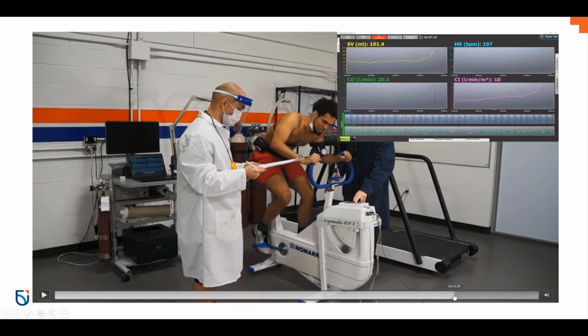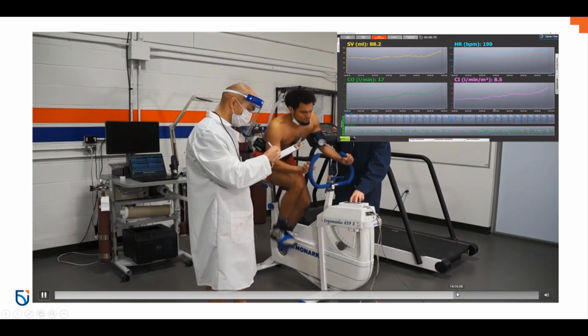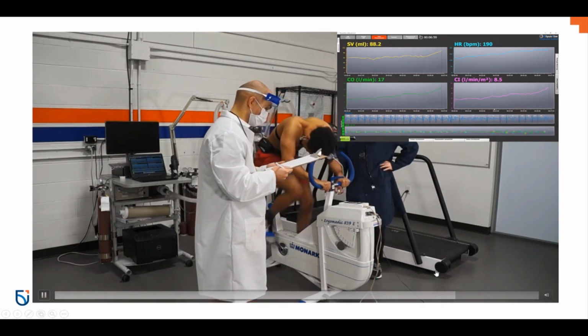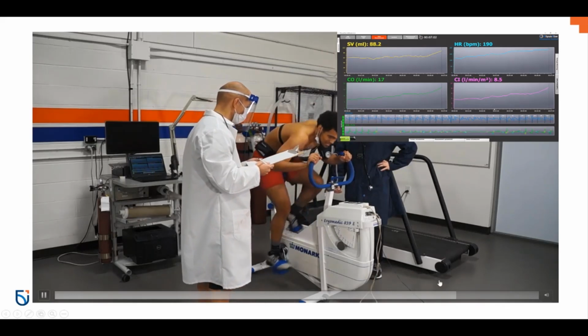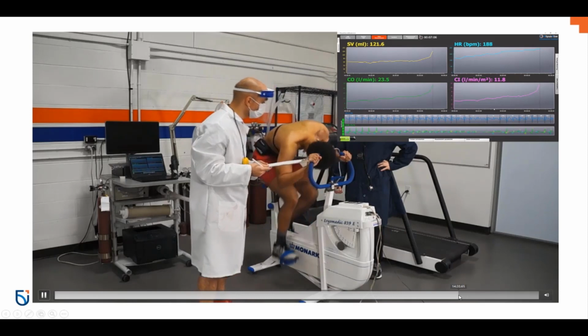I actually talked over that, but we're going to make sure right here we see that he's really got his head down. We're encouraging him, but just into the third stage here, going up to 220 watts, it's just getting too much to manage, and that's really coming from a background of not cycling.